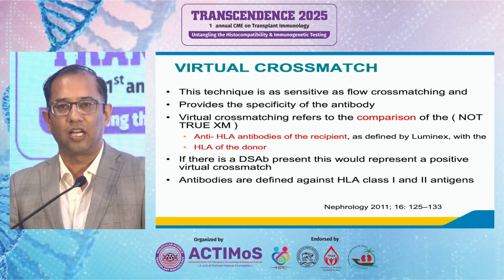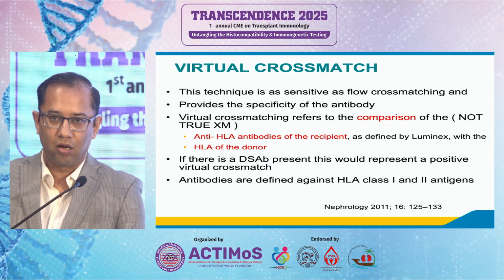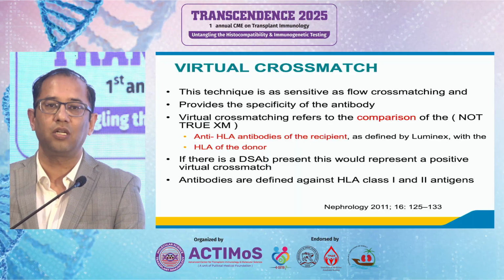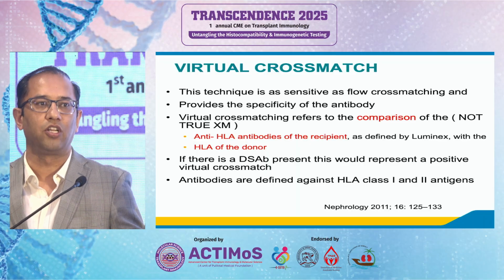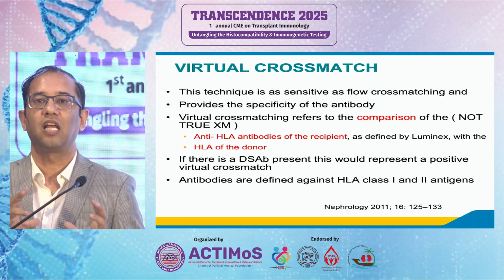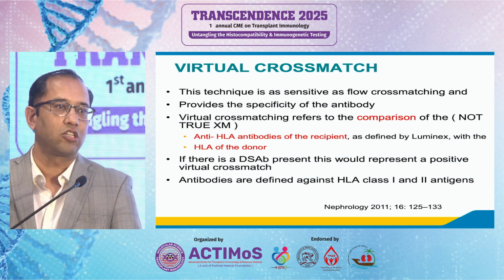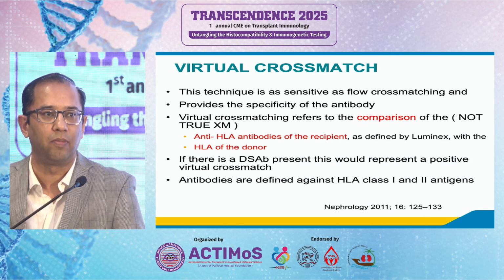Virtual crossmatch is nothing but you are trying to detect the single antigen bead assay antibody status in the patient, and you are trying to compare it virtually with the donor HLA typing to determine the donor specific antibody. So basically it's like a virtual crossmatch. It is similar to what we do as an electronic crossmatch in red cell serology or in transfusion medicine.